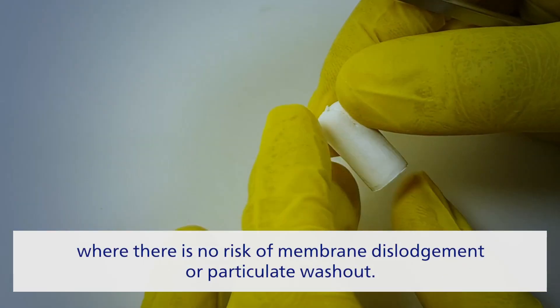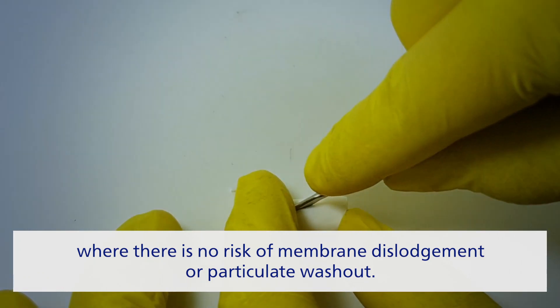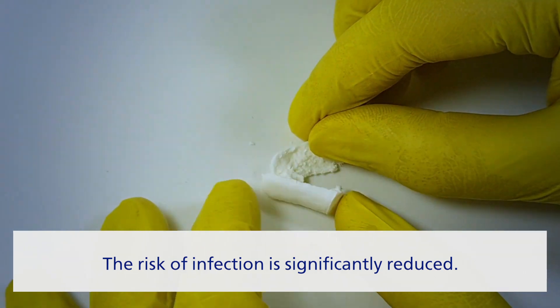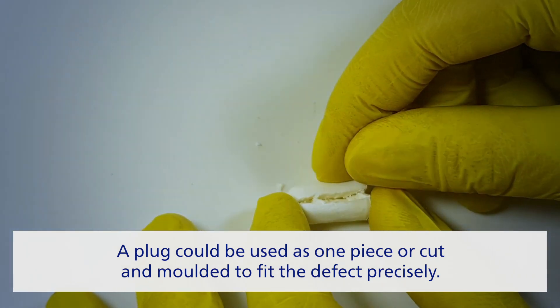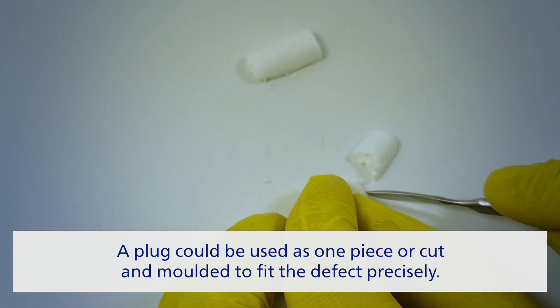It is a simple and cost-effective alternative to your typical allograft and membrane technique to repair a defect, where there is no risk of membrane dislodgement or particulate washout. The risk of infection is also significantly reduced. The plug can be used as one piece or cut and molded according to the clinician's needs to fit the defect precisely.